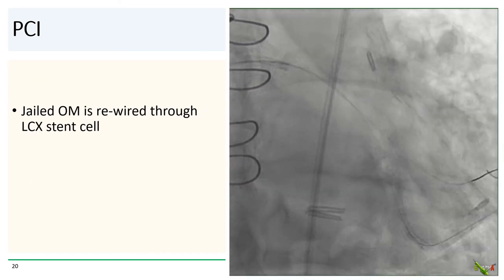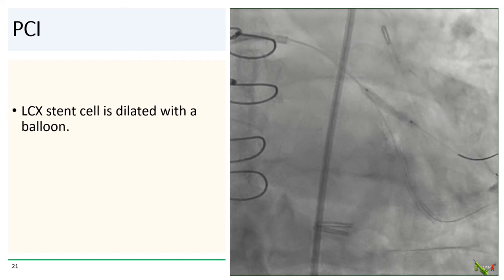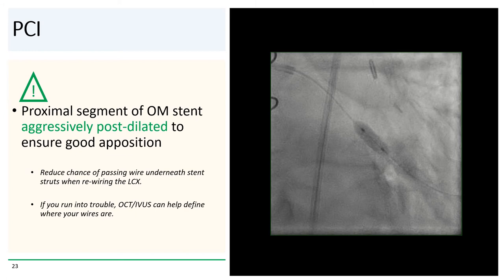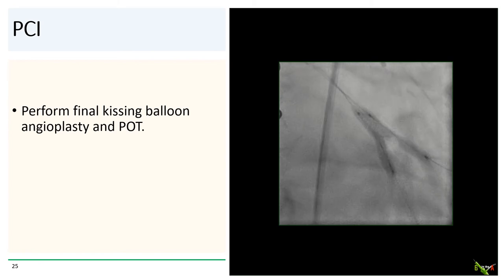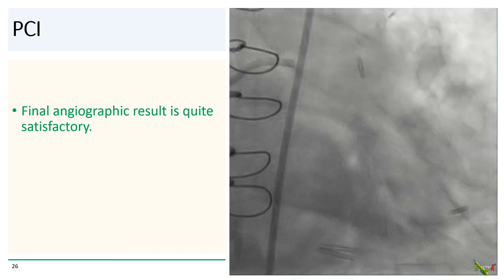After post-dilating the circumflex stent, we rewired the jailed OM through the circumflex stent cell, then dilated open the stent cell so a new stent could be passed. We removed the circumflex wire and placed the other stent from the mid-circumflex into the OM, jailing the distal circumflex. We then aggressively post-dilated the OM stent, ensuring very good apposition especially proximally, before rewiring the circumflex through the OM stent cell. Finally, we performed final kissing angioplasty followed by POT. Here is the final angiographic result, which we thought was quite satisfactory.